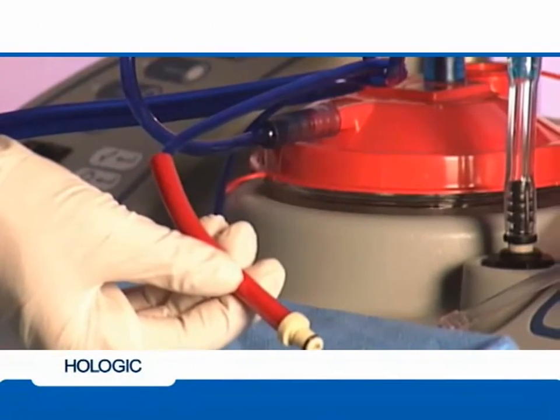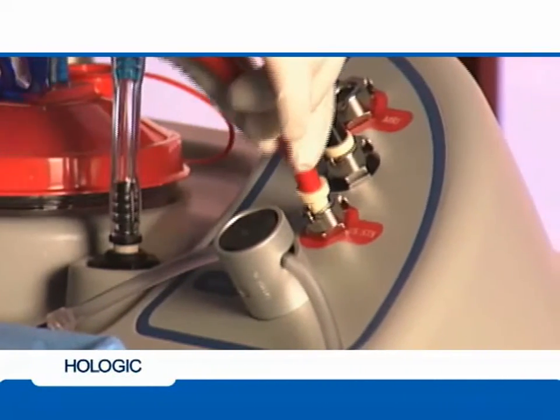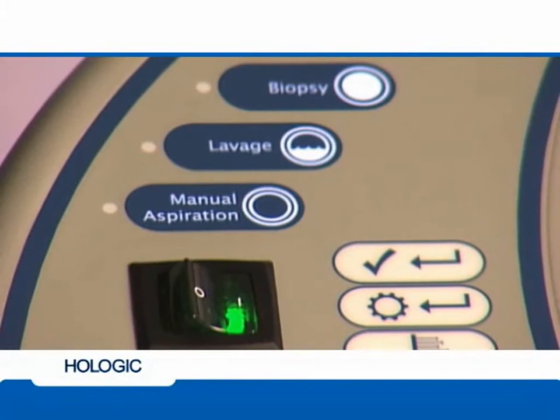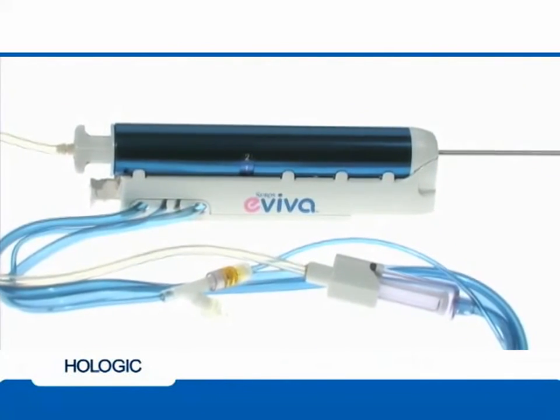Attach the black device line to the black port on the console by making sure it clicks into place. Attach the red device line to the appropriate red port on the console, again making sure it clicks into place. Turn the console power switch on and wait for it to initialize.